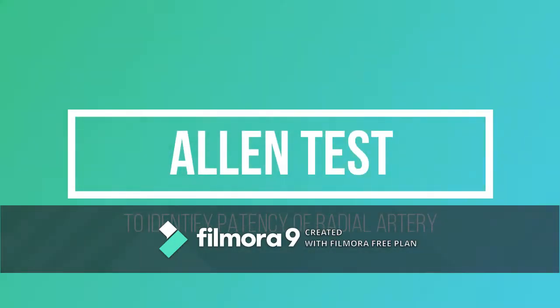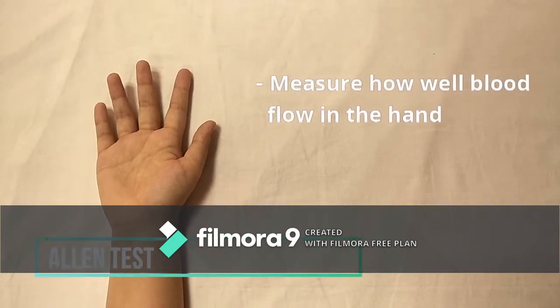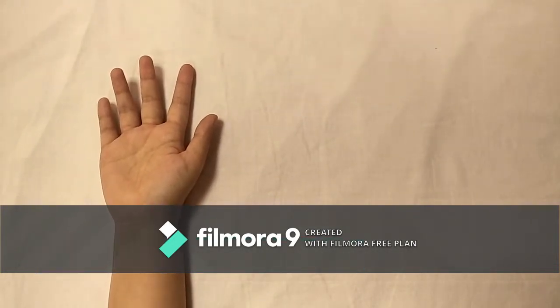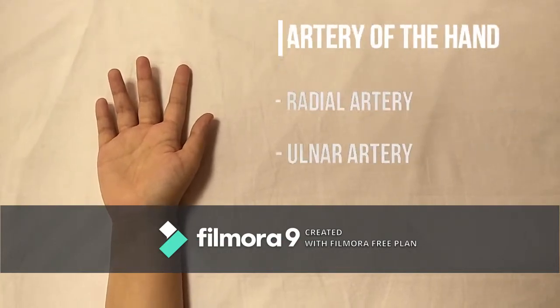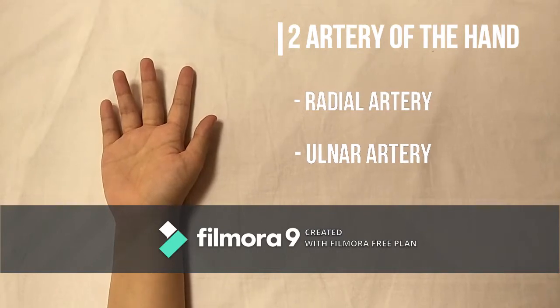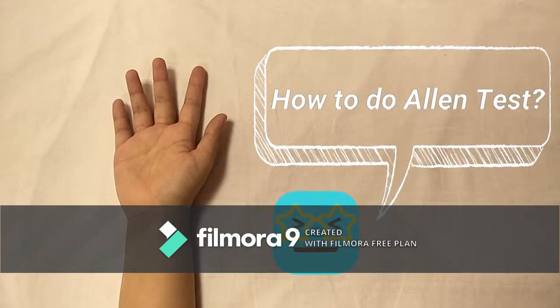Before inserting the arterial line, Allen test has to be performed to identify the patency of the radial artery. Allen test, or modified Allen test, is a simple way to measure how well blood flows in your hand. Blood supply to our hand comes from two arteries, the radial artery and the ulnar artery. Before drawing blood for an arterial blood gas test, a healthcare professional will make sure both arteries are open and working correctly. So, how will it be done?